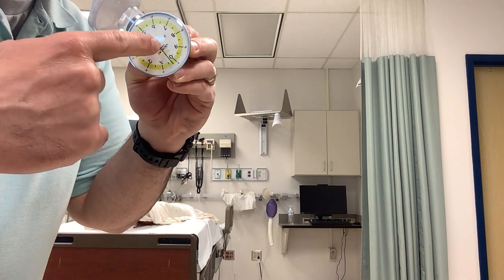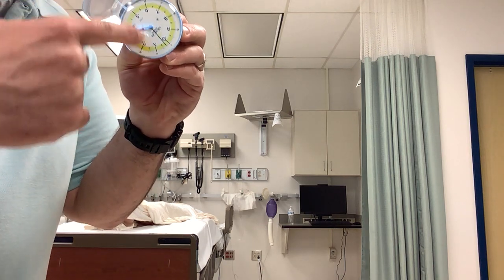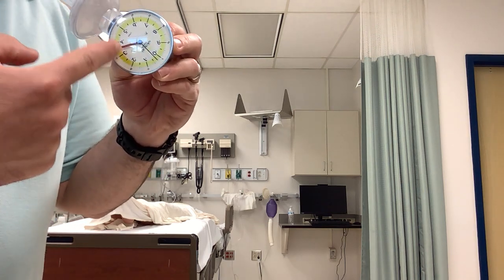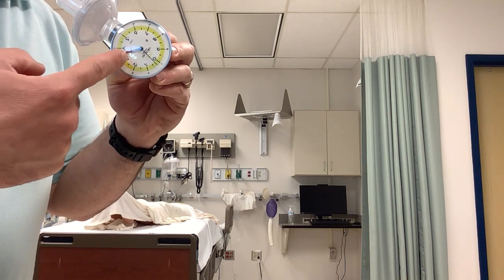So as it comes around one time, this longer needle is going to move to 1 liter, 2 liter, 3 liter, 4 liter, and so on and so on. Then the smaller needle is going to give you your decimal aspect, so your whole number with the long needle, your decimal number with the smaller needle.